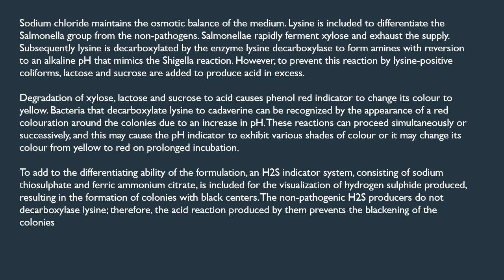mimics the Shigella reaction. However, to prevent this reaction by lysine positive coliforms, lactose and sucrose are added to produce acid in excess. So to prevent that reaction which Shigella also mimics, lactose and sucrose are added to have excess acid production, so that the reaction which is shown by Shigella can be prevented.